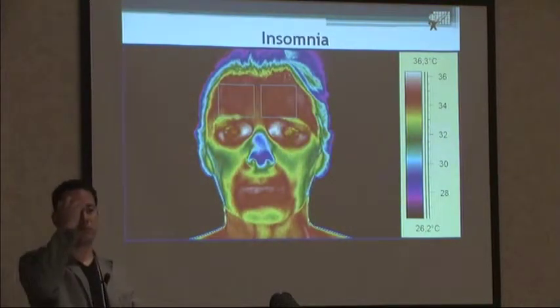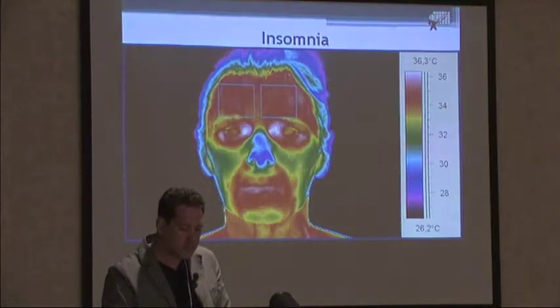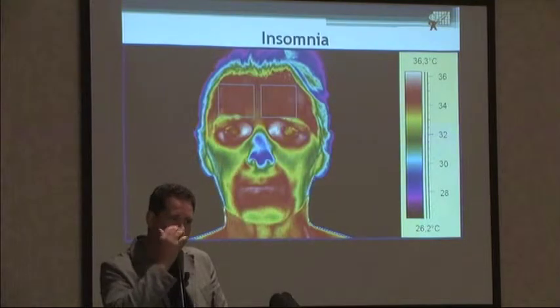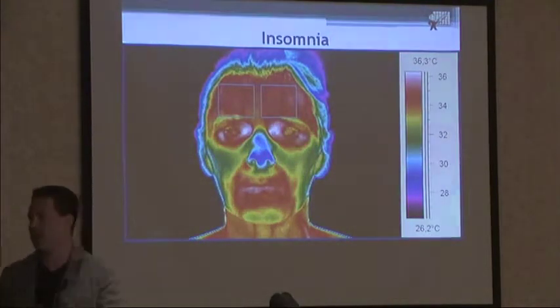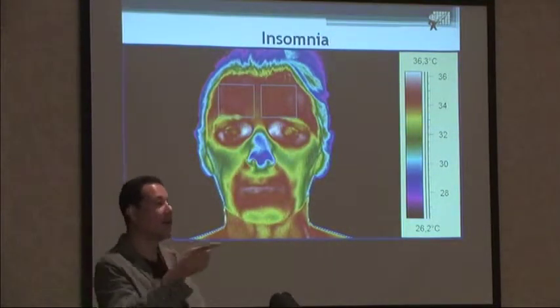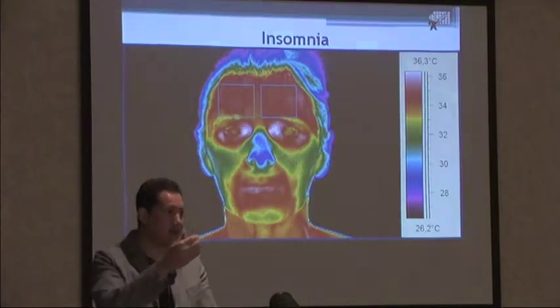Insomnia. Insomnia, it's very interesting because you can measure the temperature of the periorbital eyes, peripalpebral. And people that have problems, sleep disturbance, have a congestion of the vessels in the eyes. I don't know how to say it in English, like edema, yes, but sometimes it's visual.